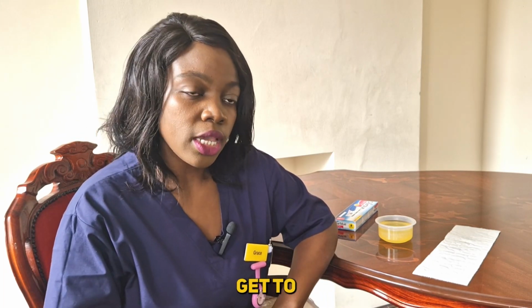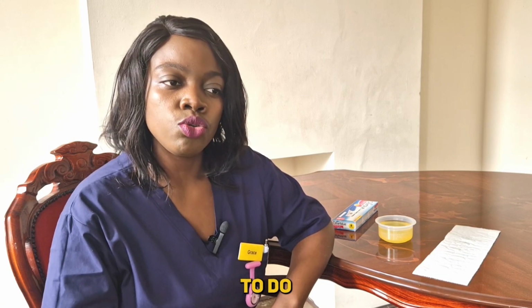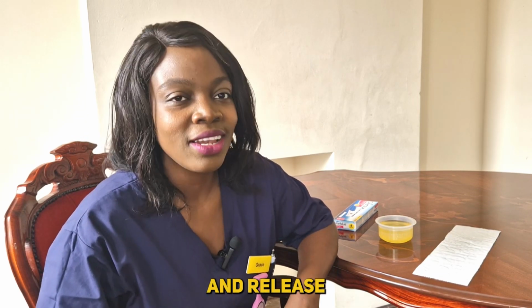If you don't get to do it during the morning, which is the best time, you can do it any other time of the day. But I would also advise you to let urine stay in your bladder for up to 3 hours if you can be able to hold it. But if not, please just go and release yourself.